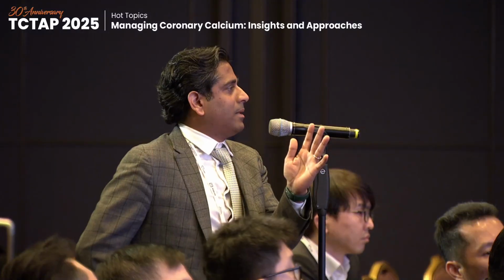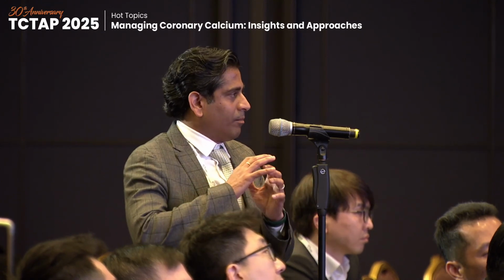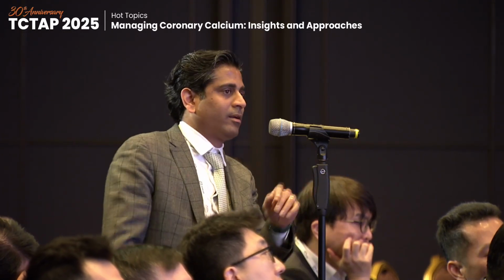So I just... No, sure, I agree. A word of caution. Exactly. I've done maybe 2 cases in the entire 9 or 10 years, so it's not something I do routinely. It's extremely distal calcification, distal left main, severe bifurcation lesions. I was worried that I'd lose the circumflex, which is why I did it. But I wouldn't recommend doing it routinely just because you have a bifurcation. So yes, I agree totally with Scott.